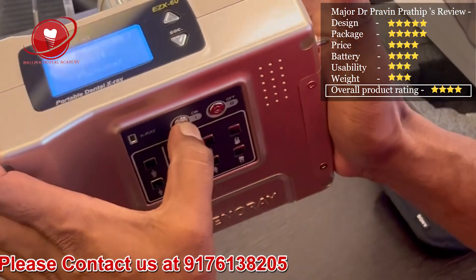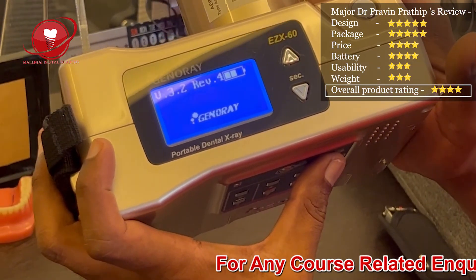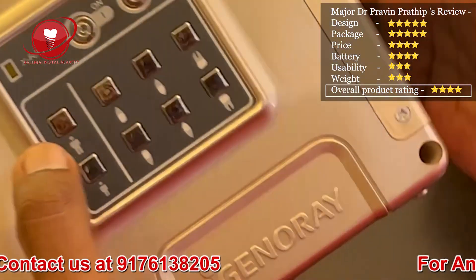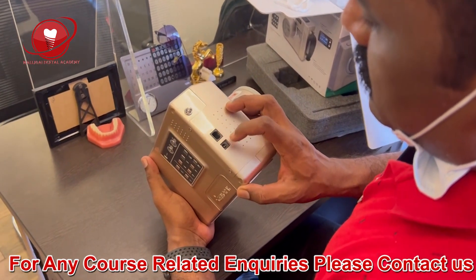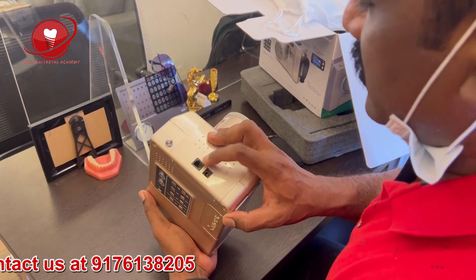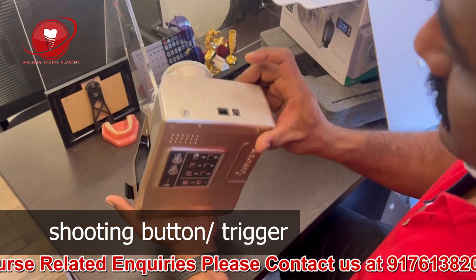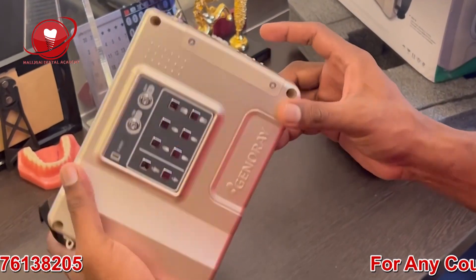There is an on button and an off button. Switching it on — it shows GenoRay version 3.2. You can select settings for big adult, kid, and molars upper and lower, and you can also manually increase the timing. There is a charging cord and a cable for connecting to a laptop or internet. This is an RJ wire — read the manual and you will understand. The battery is inbuilt — this is not a removable battery type, unlike Dexcowin where the battery is removable. This is the shooting button trigger.